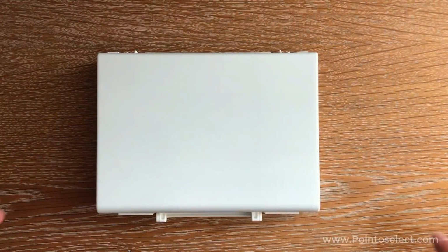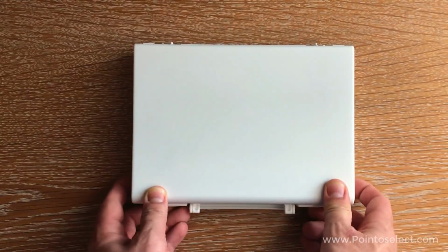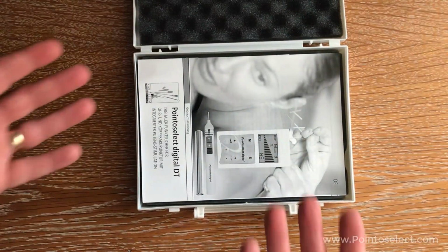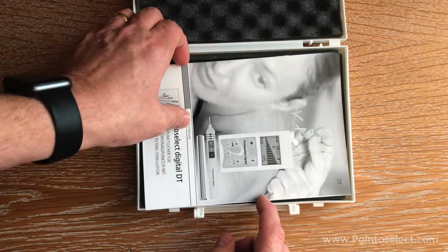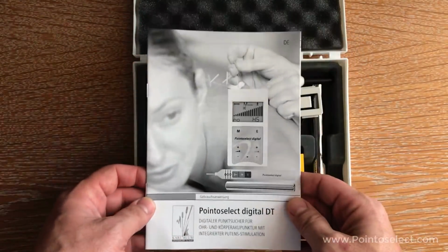Hey everybody, here I am at Senden, Germany, just outside of Münster, and I am looking forward to today because I am picking myself up a surprise. So I will look forward to showing you as soon as I get it. Okay, I got it. Here it is. Check this out. I've got the Pointoselect Digital German model. Here we go. Let's take a look and see what we get for our euros.